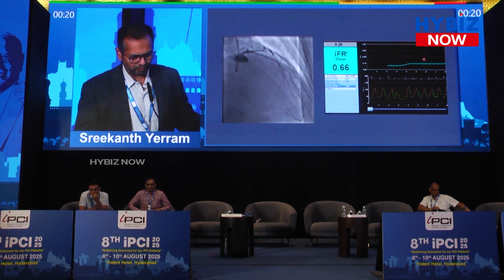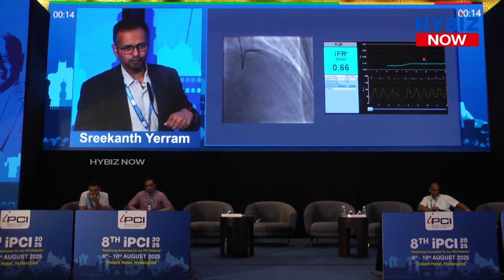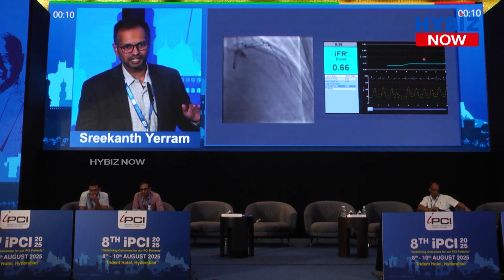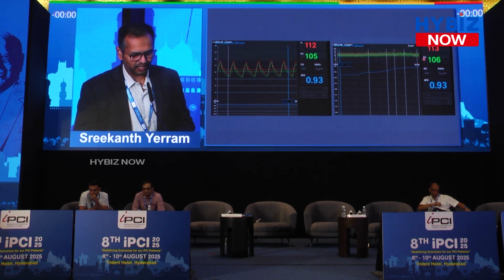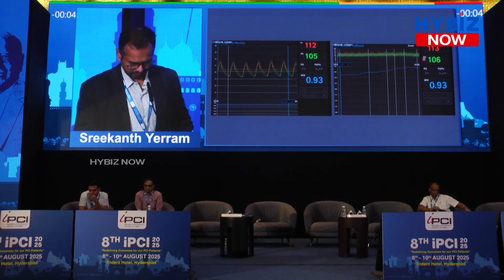See this, when we are evaluating this kind of lesions, where you have multiple lesions in the LAD, proximal LAD, mid LAD, distal LAD, and you want to assess the significance of each lesion, in this scenario, IFR, RFR are much better than FFR. And this was another patient where you can see, when we are doing RFR pullback, you can map where the significant stenosis is in the artery.